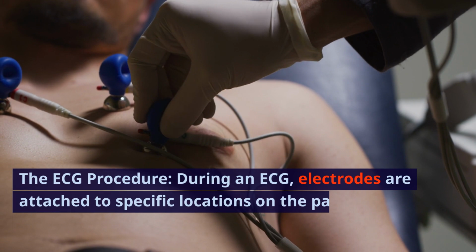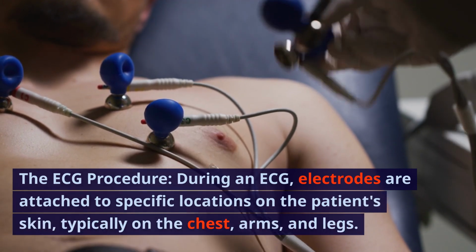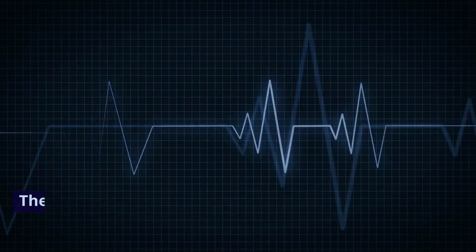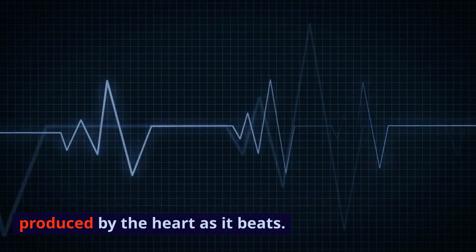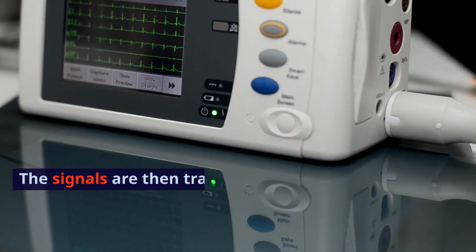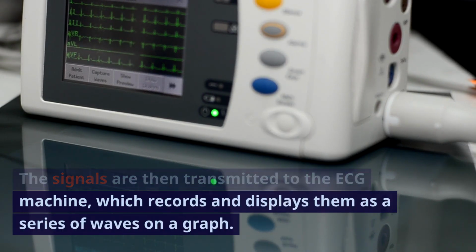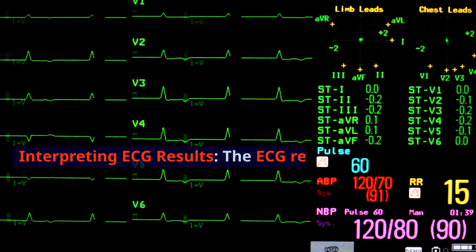The ECG procedure. During an ECG, electrodes are attached to specific locations on the patient's skin, typically on the chest, arms, and legs. These electrodes detect the electrical signals produced by the heart as it beats. The signals are then transmitted to the ECG machine, which records and displays them as a series of waves on a graph.